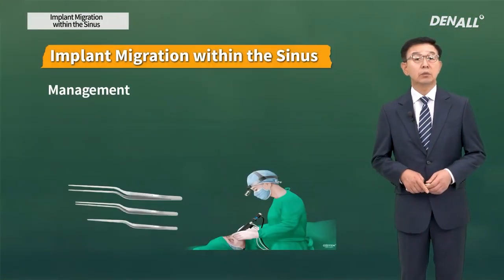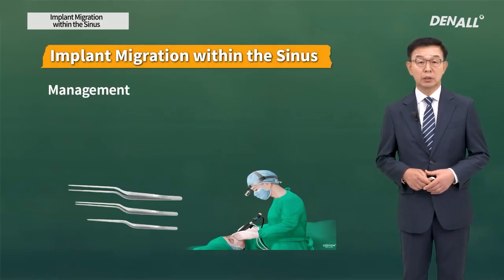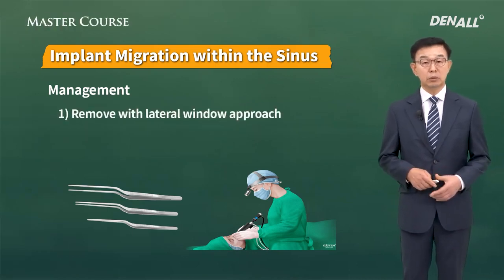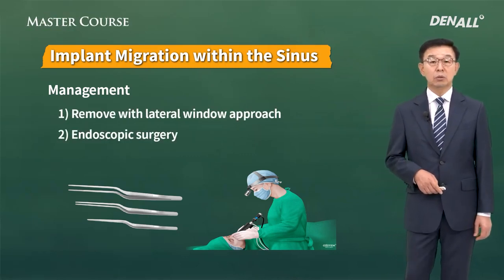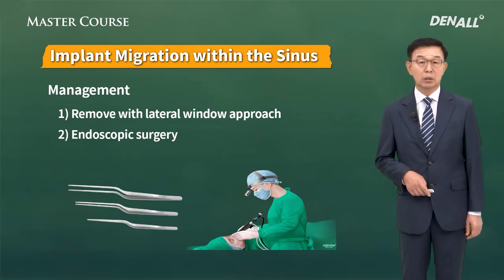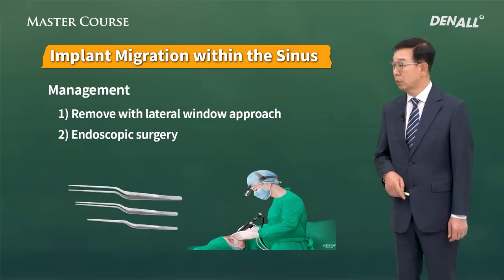If an implant migrates into the sinus, how should we address it? First of all, you need to remove it as soon as possible. To do so, you can use the lateral window approach, or rarely endoscopic surgery may be necessary. The easiest and simplest way is to do the lateral window approach to remove the implant.